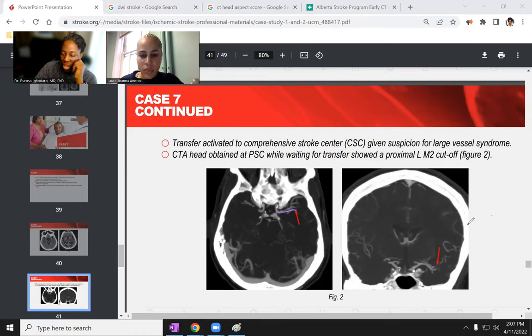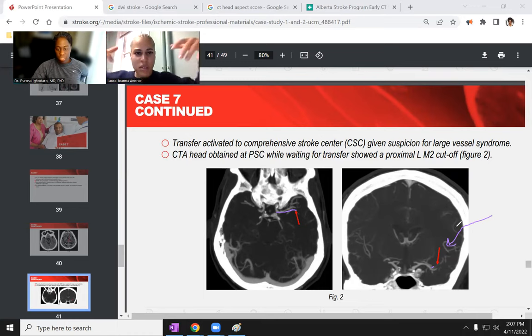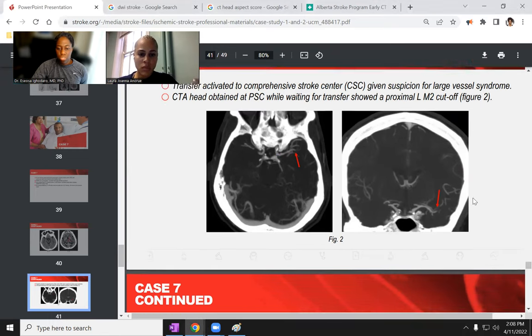And usually you would have a lot of flow. And here's an interesting question. Why do you think that past the area of obstruction, he still has distal flow in his MCAs? Would he have some collaterals? I don't know if this is true, but you've got some vertebrals and PCA, and he's got some collaterals. As collaterals from the other branches that are allowing him to still maintain blood flow to the distal MCA territories, even though he has a proximal occlusion. Yep. Nice. Nice job.